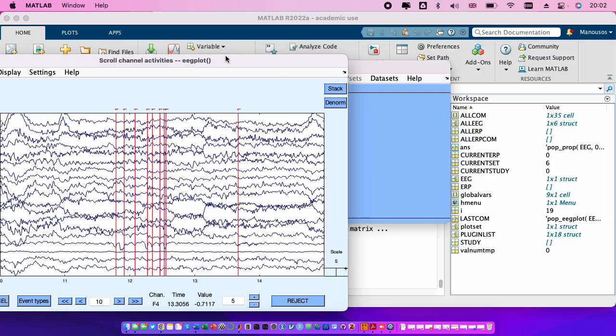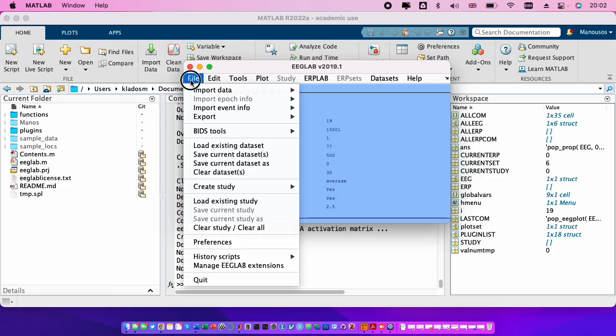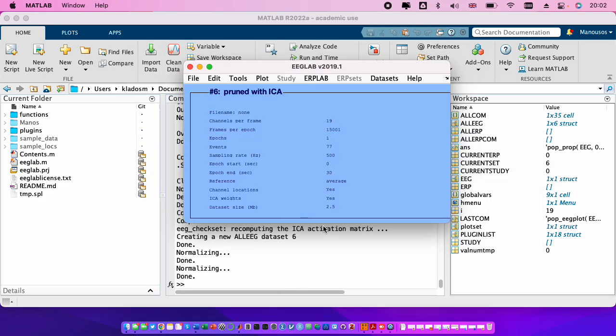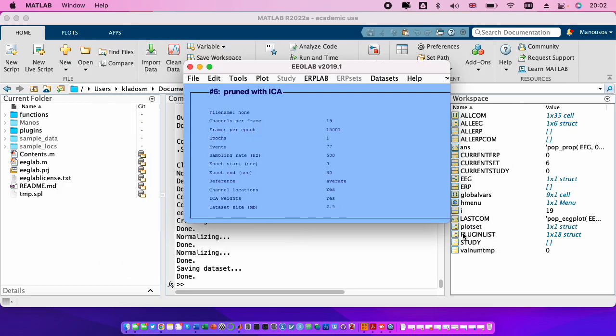Okay, now the second, the last step is to save the data. File, save current data set. We choose a name, tutorial two for example, clean. Save.